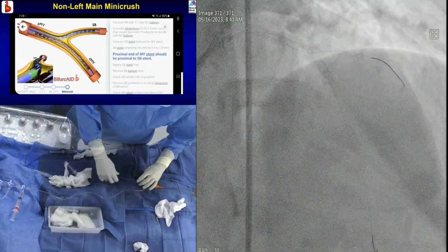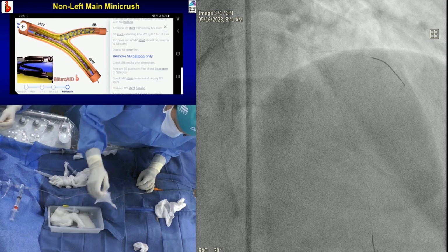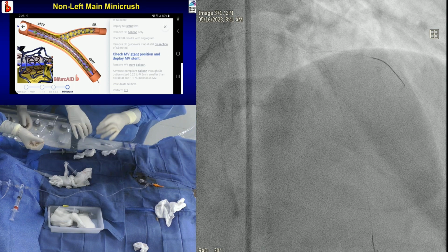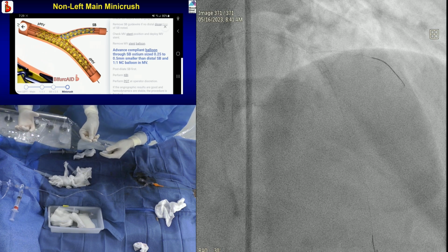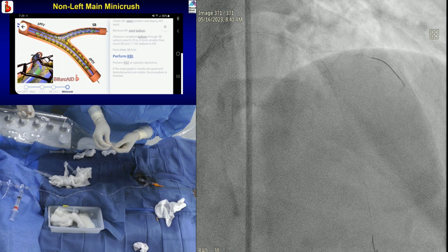Okay, so tell us about this new pink balloon. It's a magenta color, a U4 from Medtronic. Okay, compliant balloon, right? Yes. 2 at 12. We are testing it.